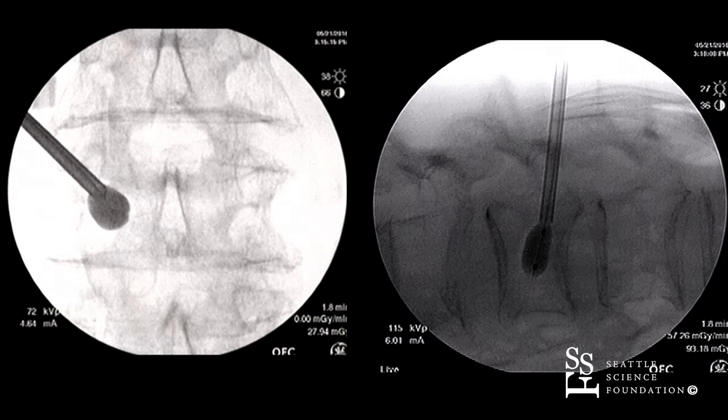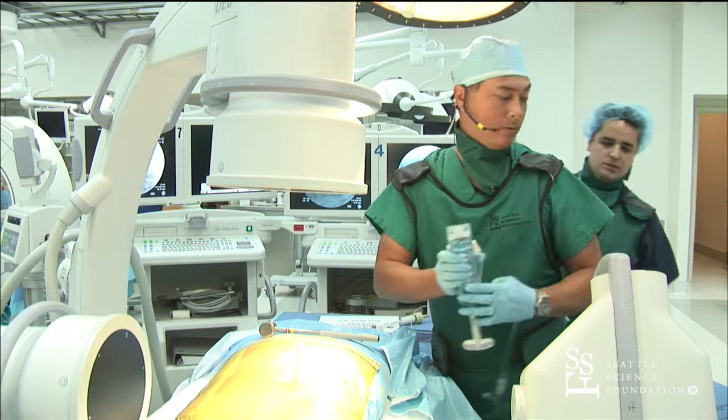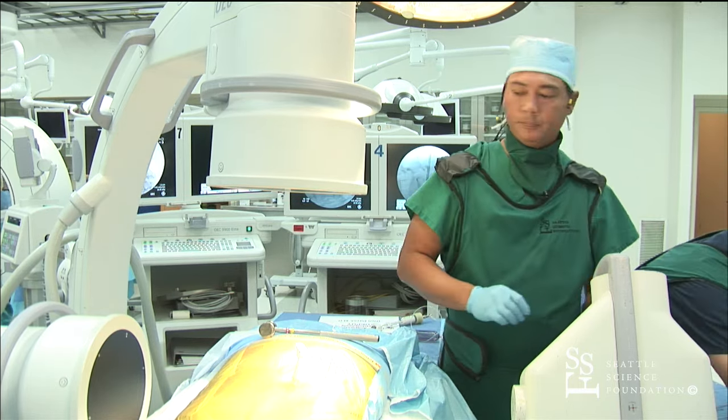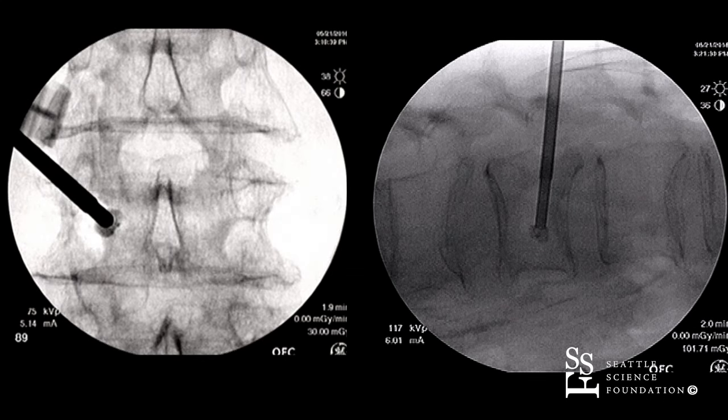Are you ready for the cement now? I'm just deflating the balloon. Introducing the cement. How many cc's do you use? For this balloon, we want to make sure you're not introducing more than five milliliters of polymethyl methacrylate. In terms of obtaining pain relief, anywhere from two to three cc's of cement is required.